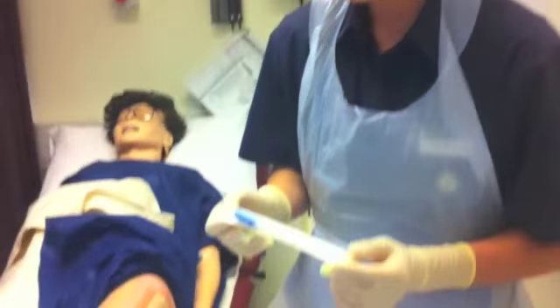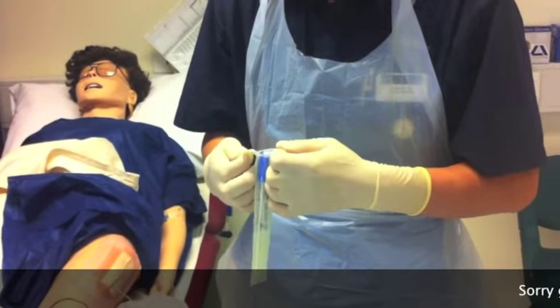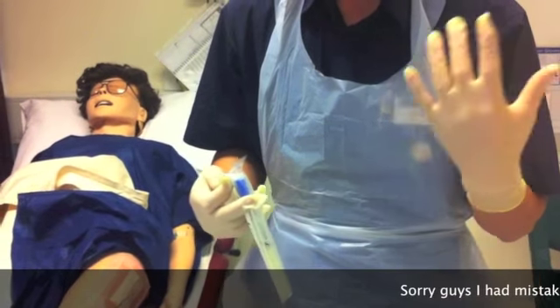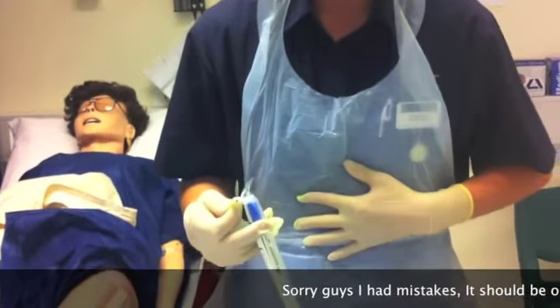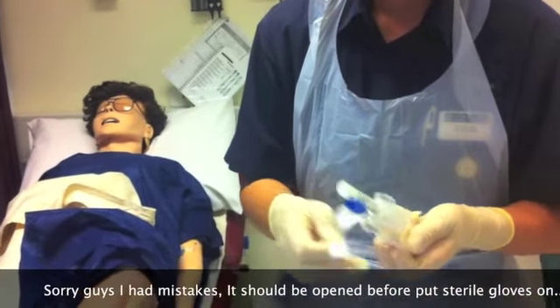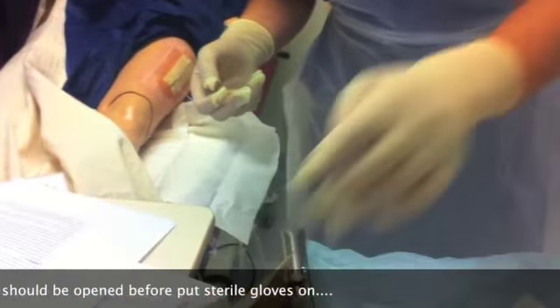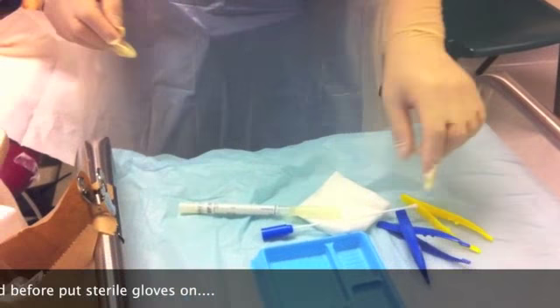I want to obtain a drain culture to send for examination. It's an aseptic procedure, so I need to ensure I undertake hand hygiene and wear an apron and sterile gloves. Put in here.